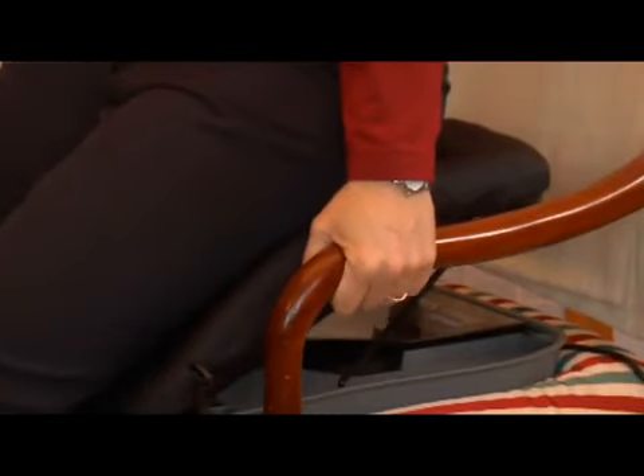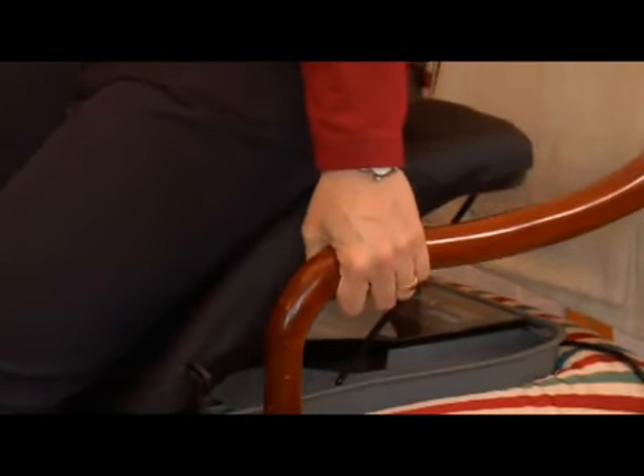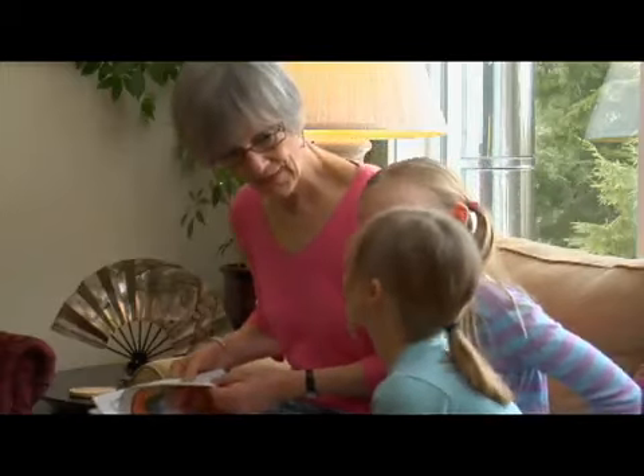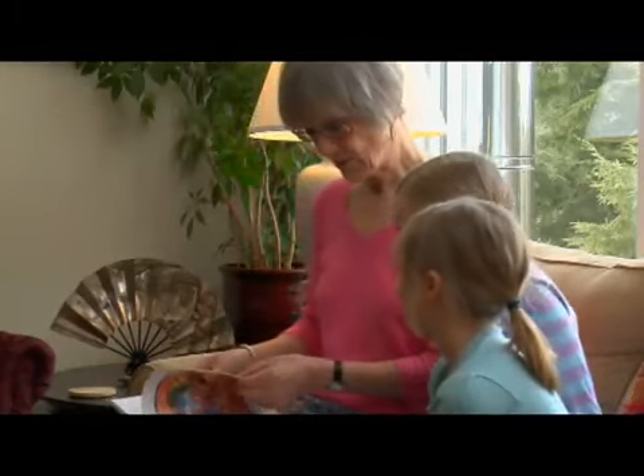The PowerSeat can be used in almost any room in the house, wherever you have a power outlet and a stable armchair or sofa. Don't let arthritis or sore joints compromise your quality of life, or the quality of life of those you love.